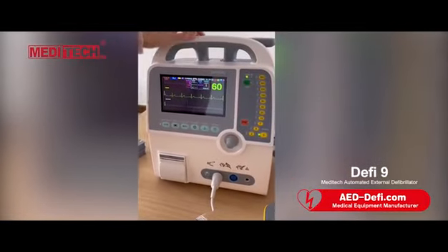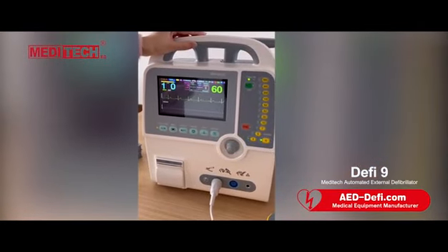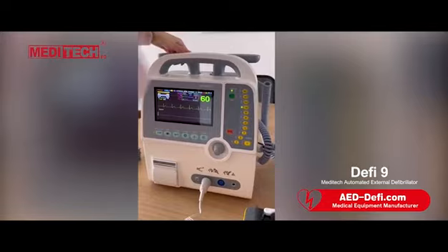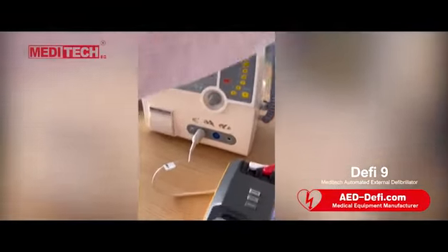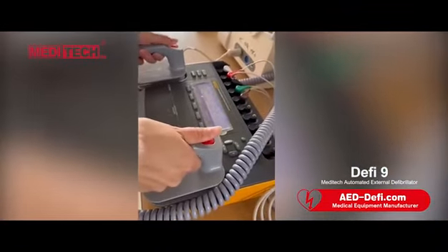For example, we press 100 J. You can see 100 here. Stand clear. Press shock. Let's do discharge. Press this button. Shock delivered.